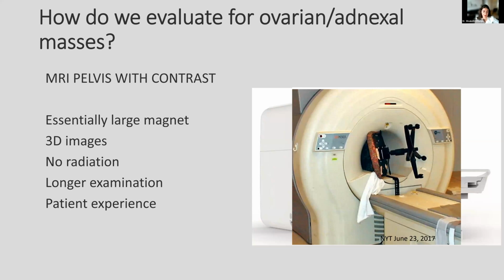It's also much longer compared to an ultrasound, and some patients don't like it because it's quite a noisy examination, although they're less noisy with newer scanners, and it can also be a little bit claustrophobic for some patients. And most importantly, it isn't always necessary. We can get a lot of really good information with ultrasound. So if you're not offered an MRI, your standard of care isn't any different. It may be just that it's not needed in your situation.